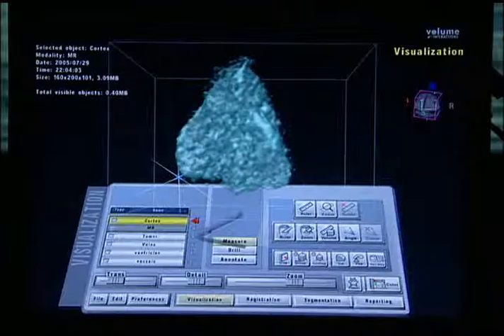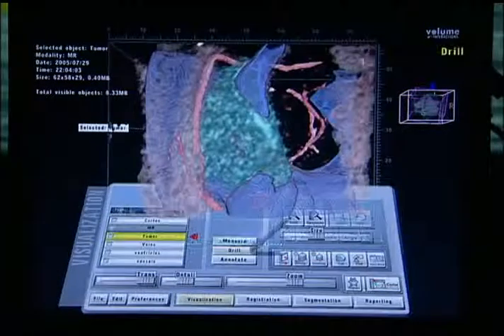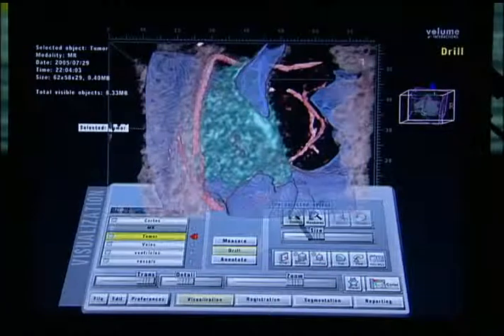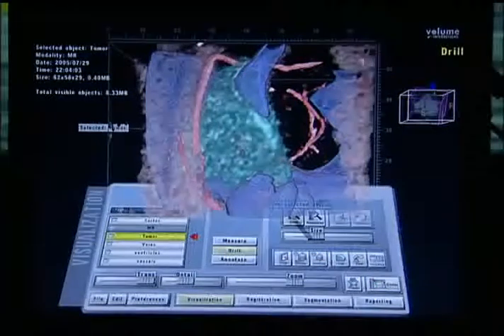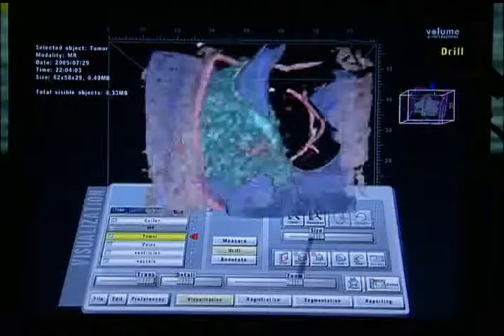I think it allows us to see things that we don't see easily with the same images that we're using normally towards navigated approaches. So it doesn't take a lot of different types of MRIs or other scans.